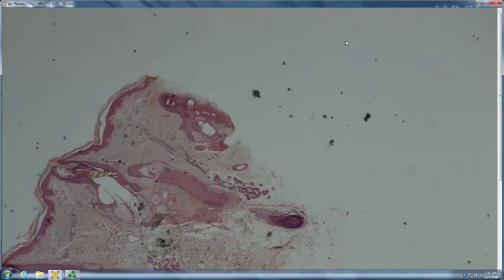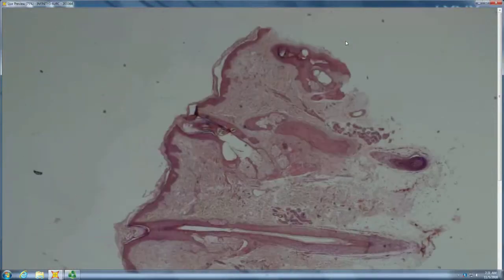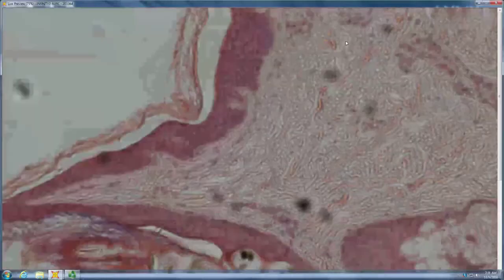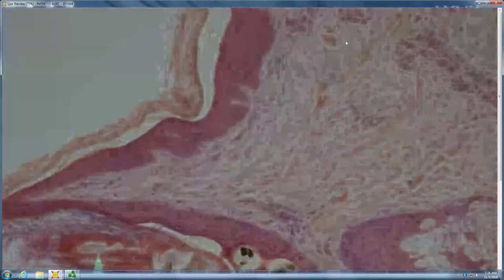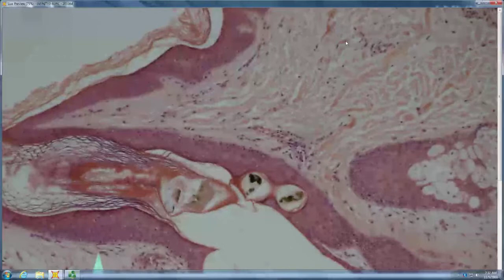If you see true trichomalacia, that goes much more with trichotillomania, and in this case, you have not just pigment cast, but a whole hair shaft that's kind of turned to jelly here, and that's trichomalacia, right? So when you see that, you're more confident that you can rule out alopecia areata and syphilis, and it's probably trichotillomania.